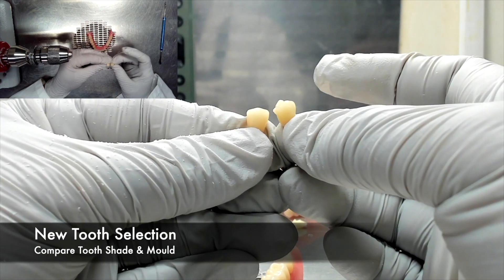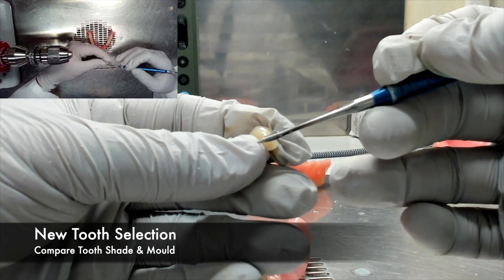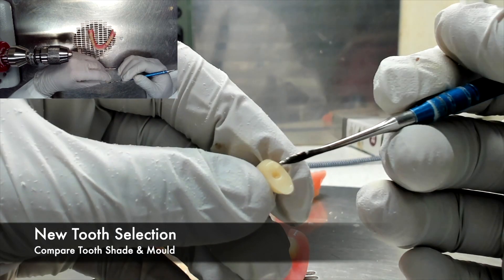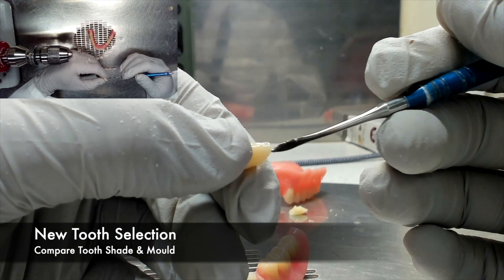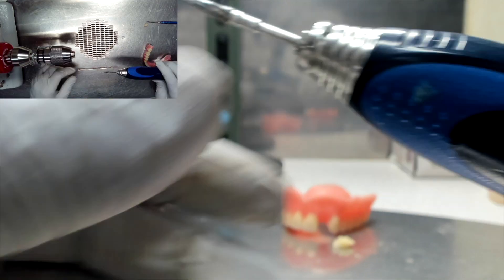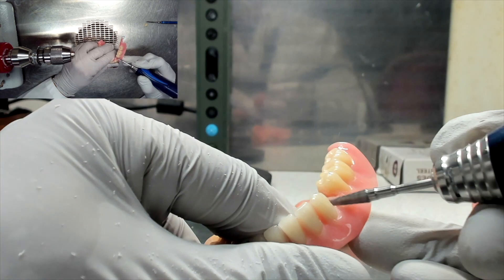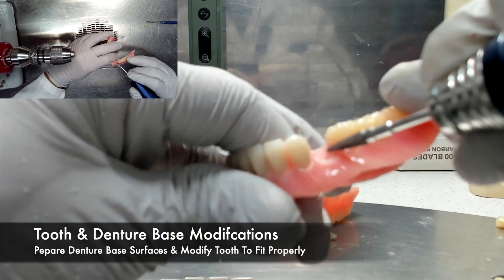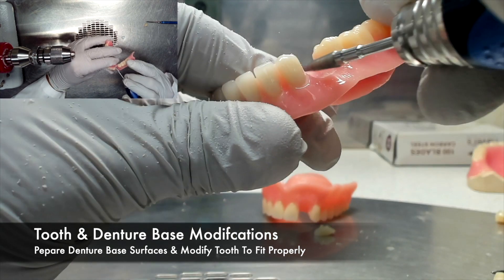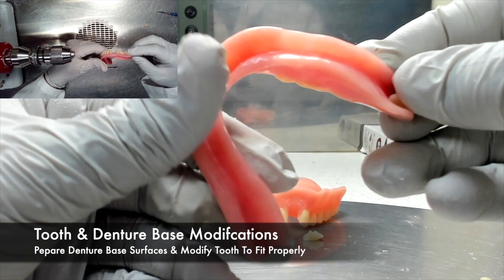If the original denture tooth is compromised, then you must select a new denture tooth that matches the shade and mold of the one that is missing. Once the proper tooth is chosen, it will probably need to be modified in order to fit into the denture base properly. It is important to remember that the tooth and the denture base are made out of acrylic, so if adjustments to the tooth need to be made, chances are you can also make adjustments to the denture base itself.